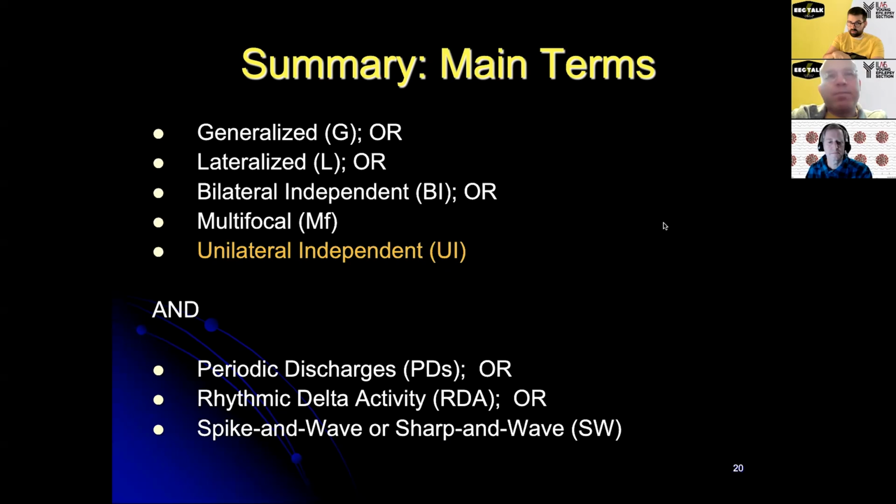Is that your algorithm? Not necessarily. I might start with main term two, but I definitely start with these two main terms. Which order? I don't know. I think you just kind of immediately recognize them after a while, at the same time. Although sometimes you'd be like, oh, I'm not sure if it's generalized or more on one side consistently or not. So then you just first figure out if it's periodic discharge or RDA and then concentrate on it.